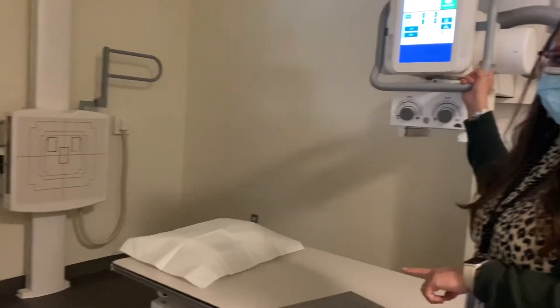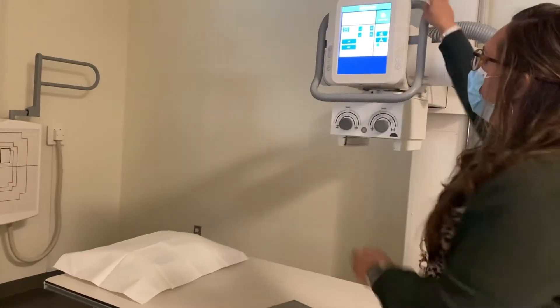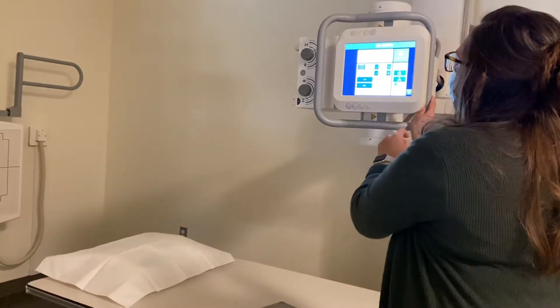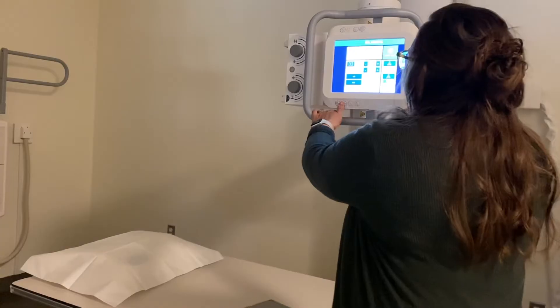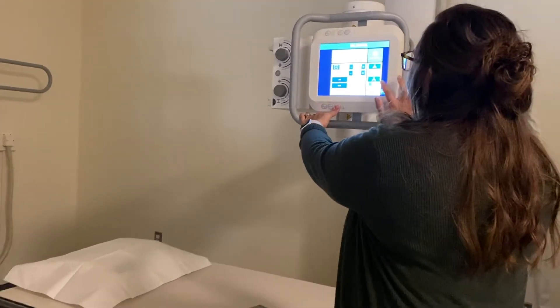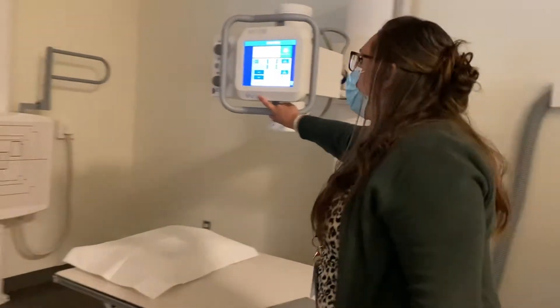For an abdomen series, we're going to do the upright and then the supine. The first thing I'm going to do is angle my tube towards the upright bucky, make sure that I'm on the correct detector — the upright bucky — make sure that I am in transverse detent and have the yellow light. I'm going to make sure that I come into a 40-inch SID.